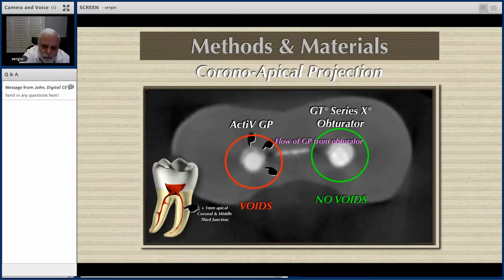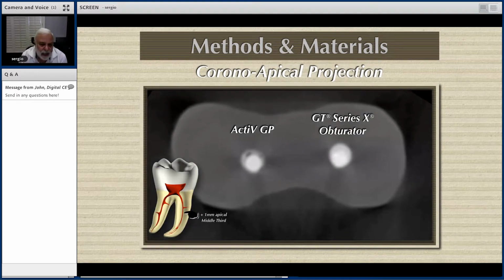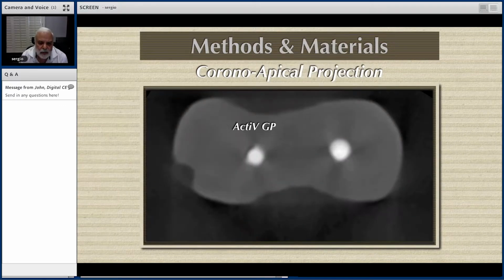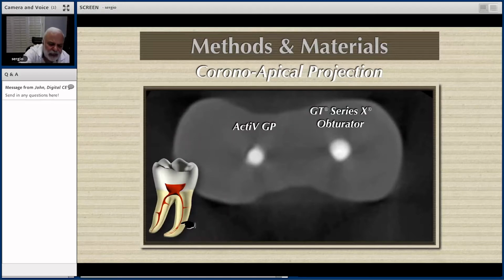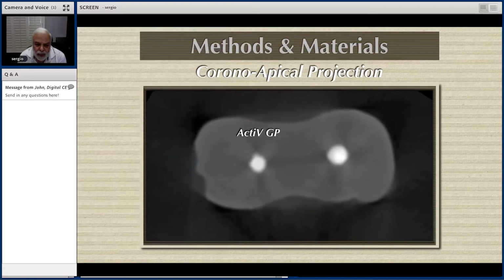And how the material is flowing from that canal. It's trying to fill that gap. And it's because of the hydraulic forces of this type of obturation. Once again, let's go a little farther and fast on this. They are full of voids all the way until you get to the working end. Look at this giant void. And this is the junction between the apical and middle part of the canal, that big void.